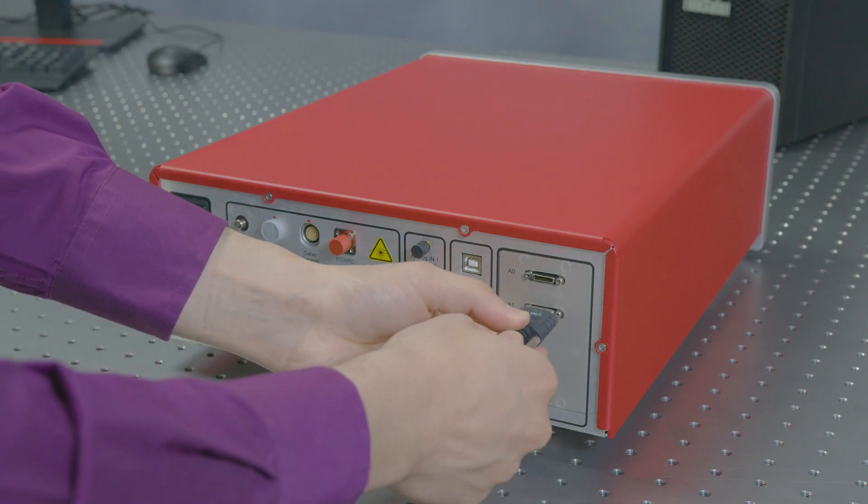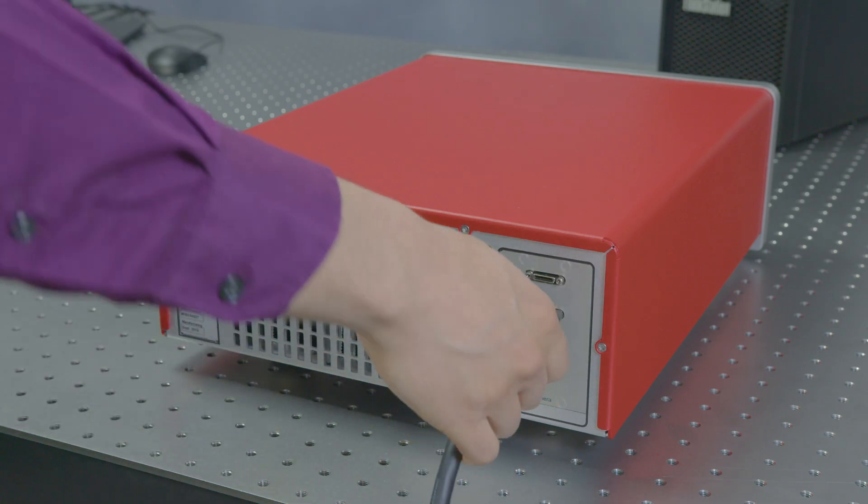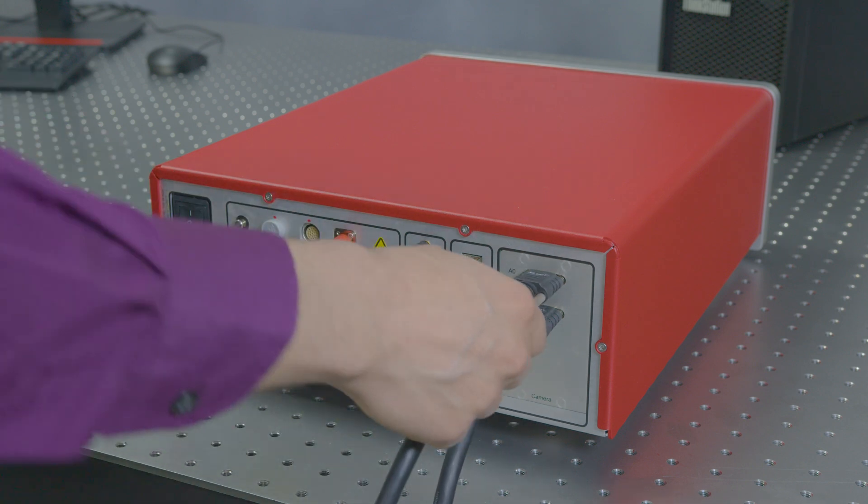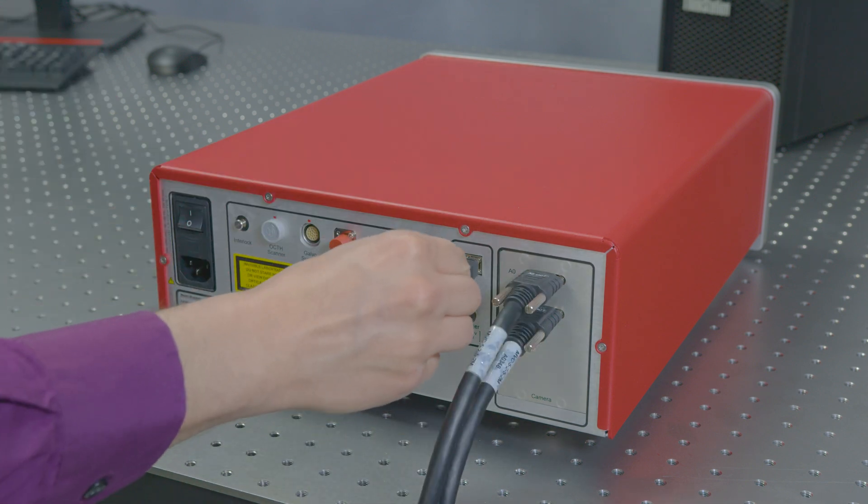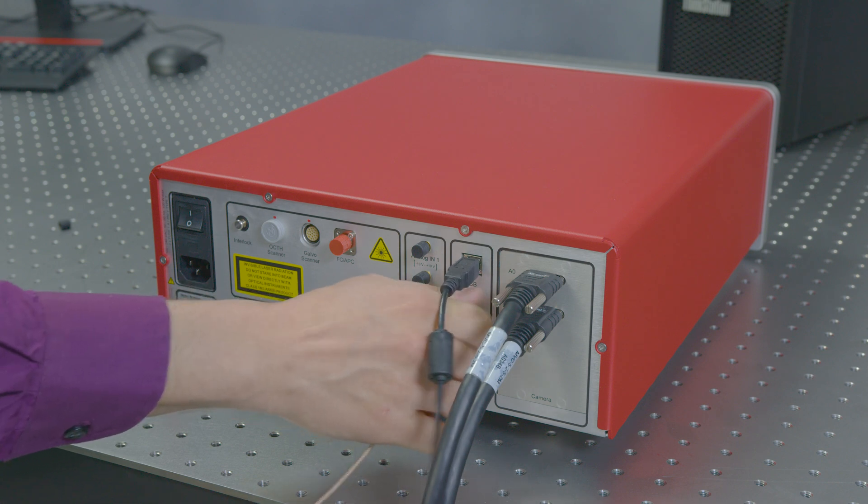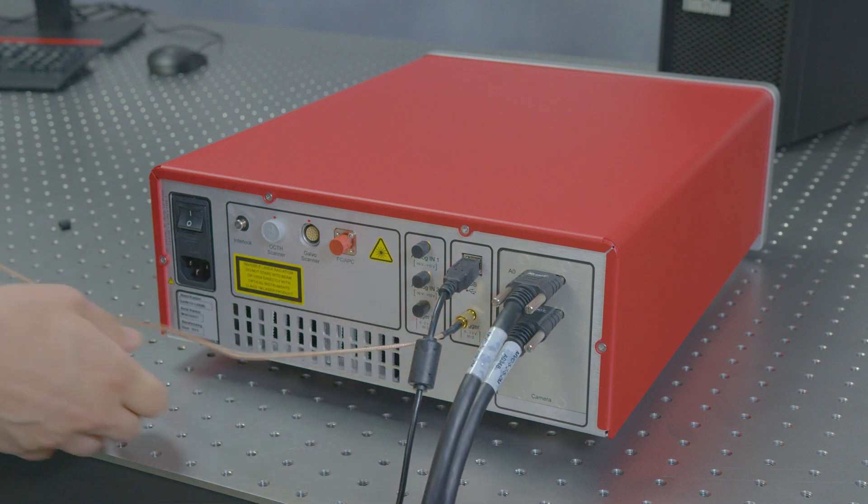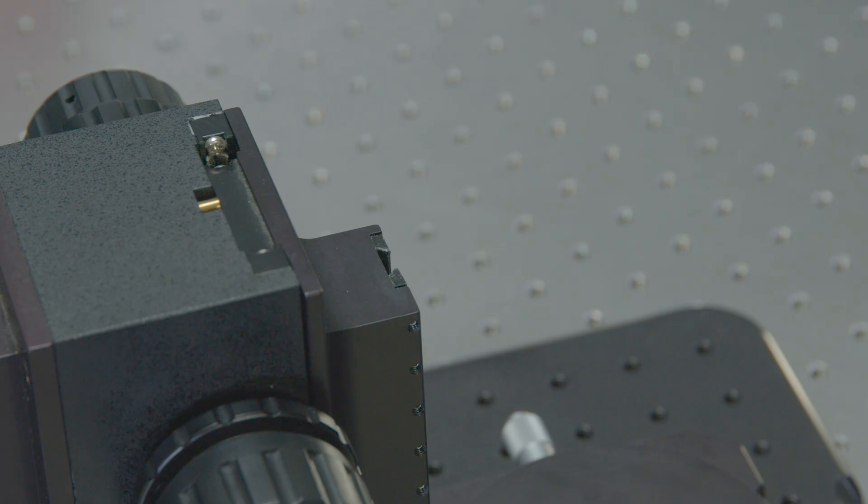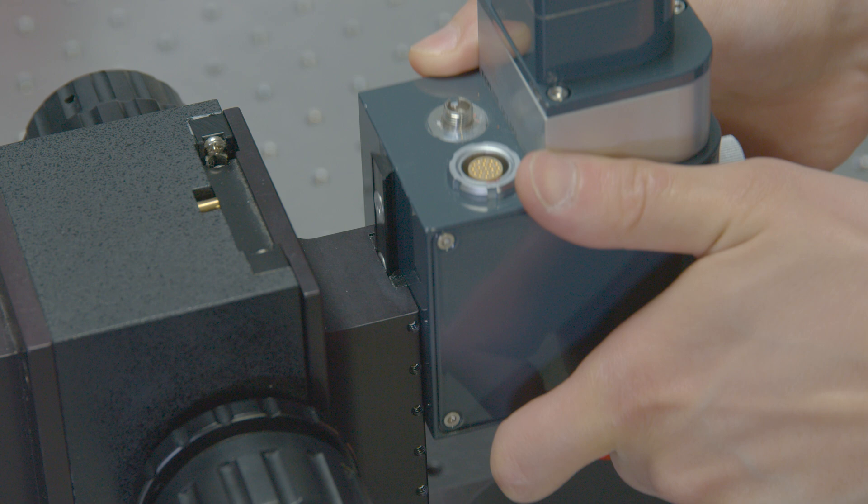Attach the appropriate cables from the OCT system to the computer. Refer to the quick start guide for details. Slide the scanning unit into the base via the dovetail adapter.